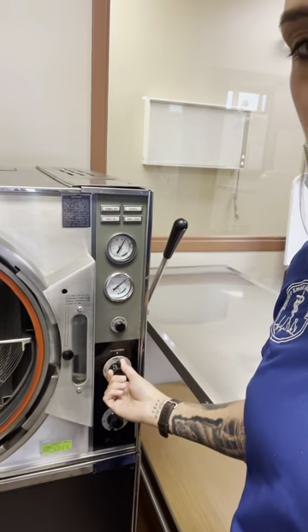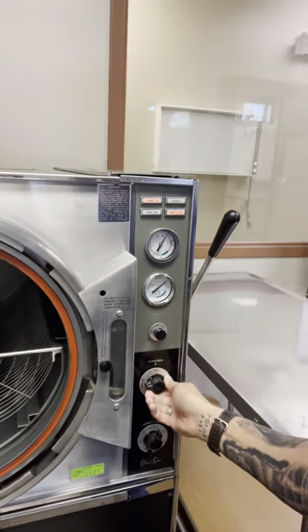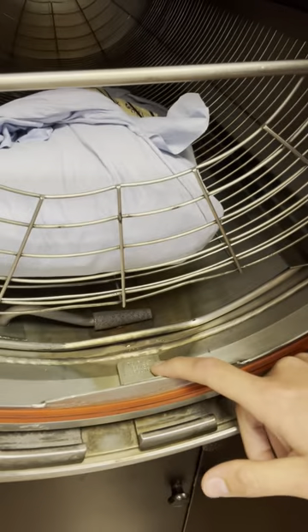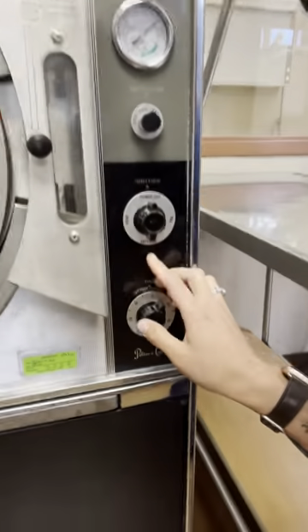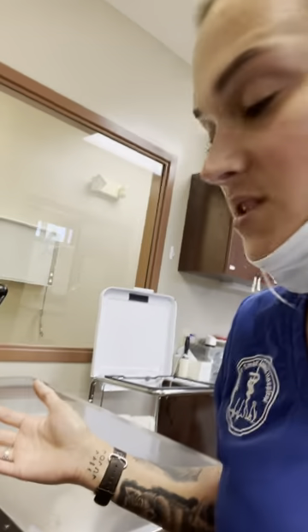Close this, push this back in here. This is our function button — you're going to flip it to fill. Let it fill down in here until this little bar right here is covered. It says to fill to cover this plate, so you let it fill to that. Then you're going to flip that same function button to sterilize, and it'll kick on and start building up pressure in there.